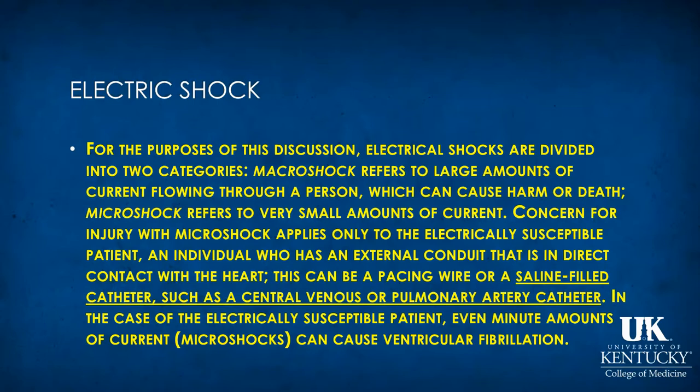The presence of these catheters in the heart has caused ventricular fibrillation in susceptible individuals in the past, and is a very real and risky situation, and sometimes would not necessarily be the first thing you think of when somebody fibrillates. However, if they have a central line, it is not outside the realm of possibility.